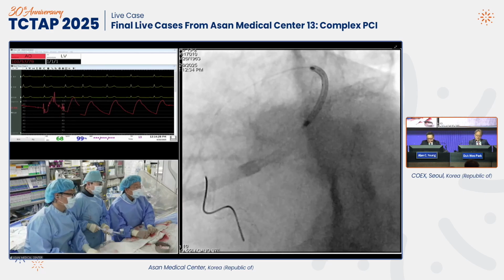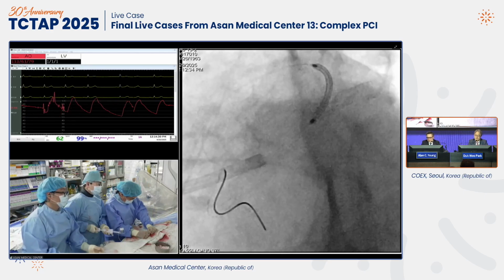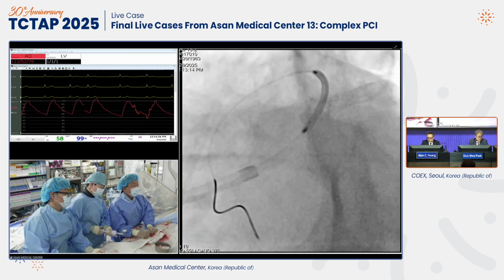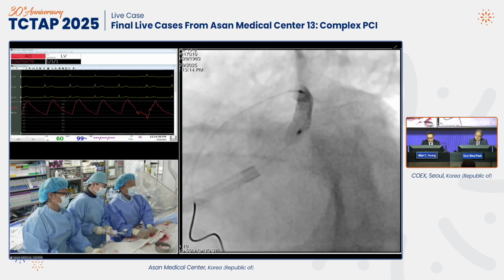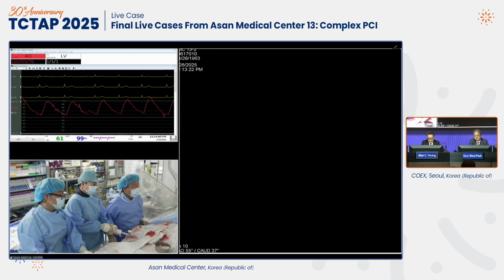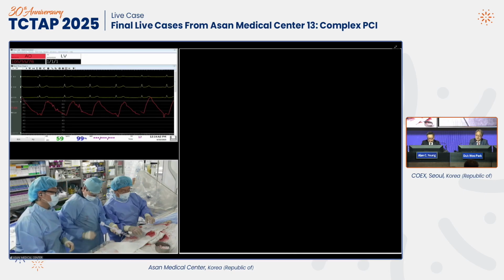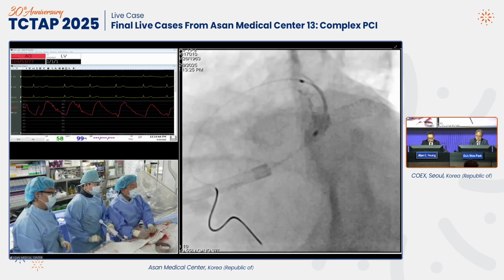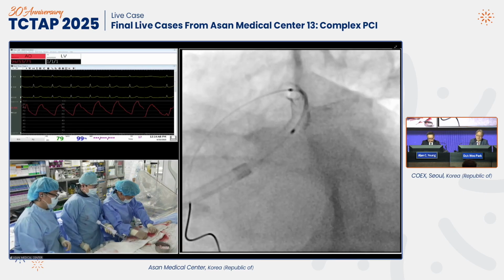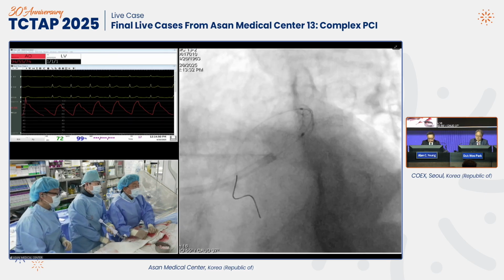It's okay? All right, inflate. Okay, 35, 33. Okay, big, large stent, just a crossover.